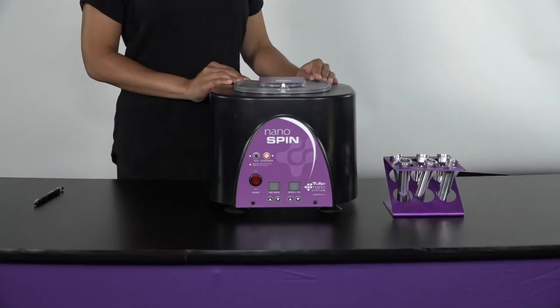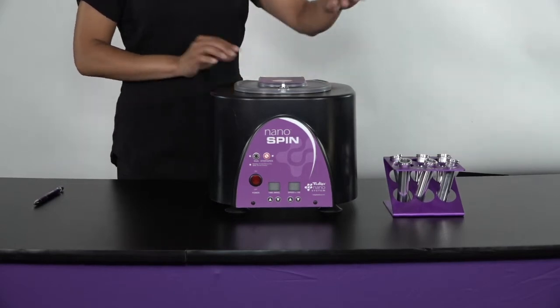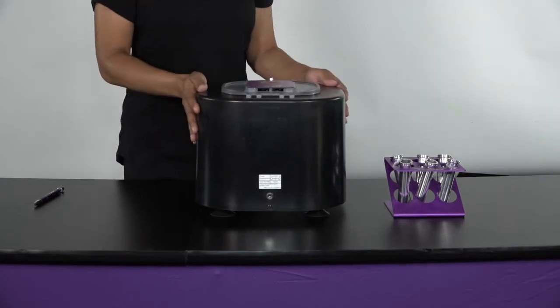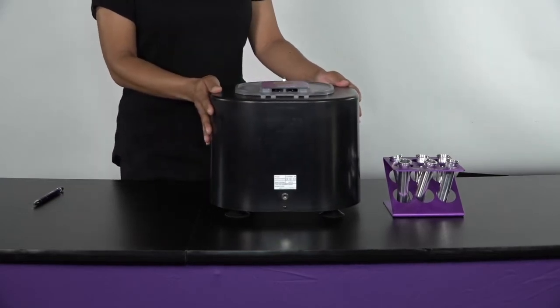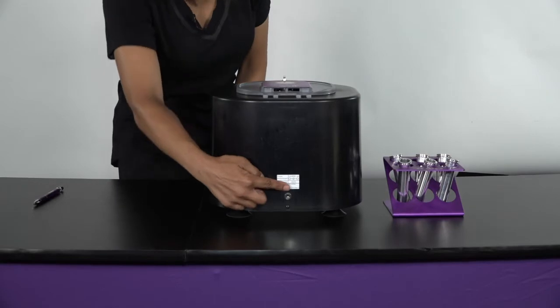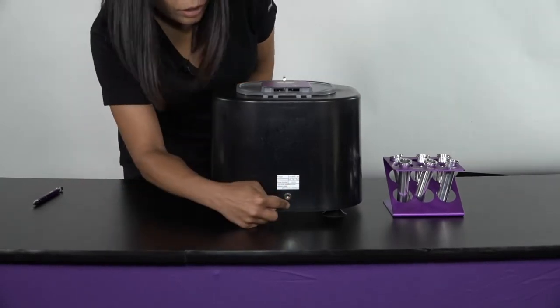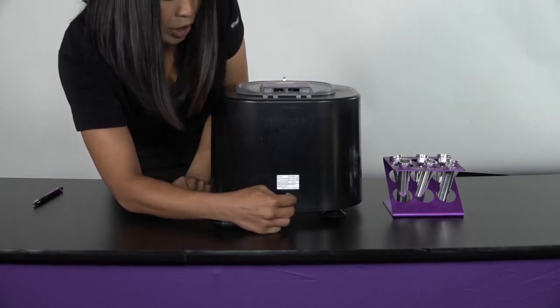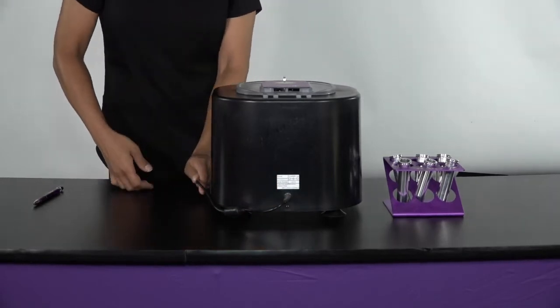The first thing I'm going to go over is the centrifuge — where to plug it in. In the back of the centrifuge, it's a very light, compact centrifuge, so it's easily turned. There's a little plug slot here and you just take the end of the plug, really simple, and pop it in, just like so. And you're ready to go.